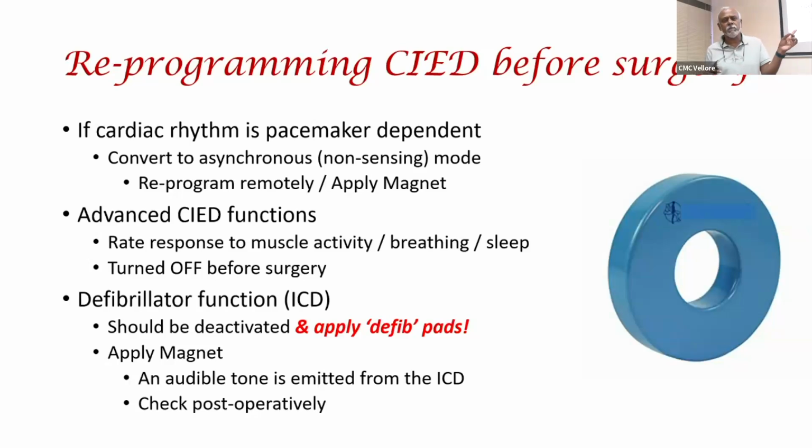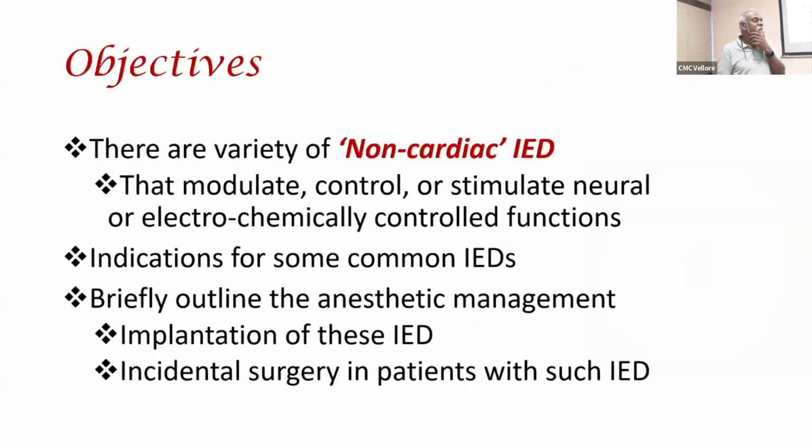The thing about ICDs which have a pacemaker: the pacemaker still functions, but the ICD is turned off. And when you take it off, they also make some loud sounds. After the surgery, you have to make sure there's nothing wrong with the ICD, that it's still functioning and you haven't done anything wrong.